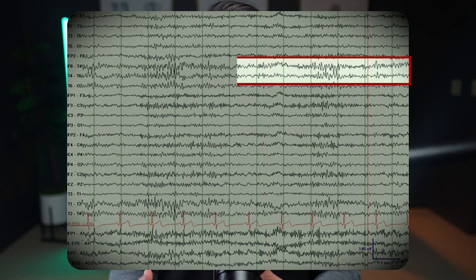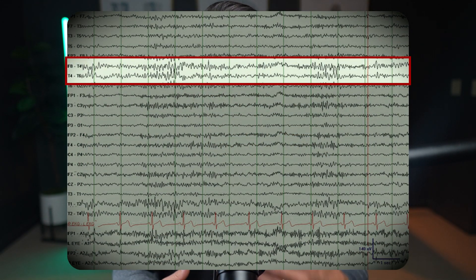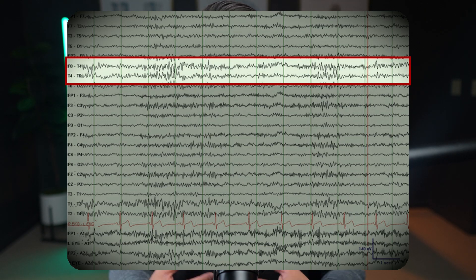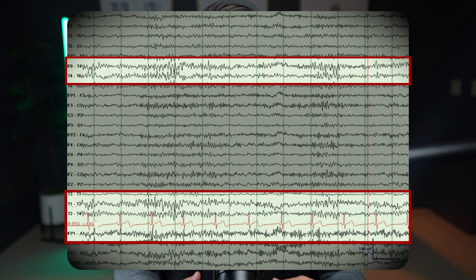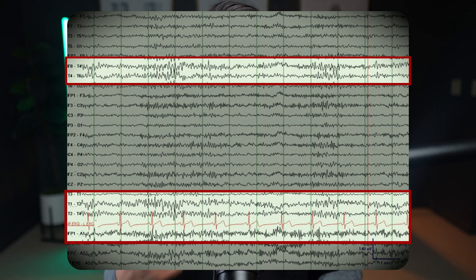This increased amplitude, often more than three times the typical beta activity, is a result of the lack of skull to attenuate the faster frequencies. This EEG shows a breech rhythm in the right temporal region, maximal at T4, following a craniotomy for a temporal lobectomy. Notice the higher amplitude beta activity in this area, illustrating how the breech rhythm can manifest on the EEG.